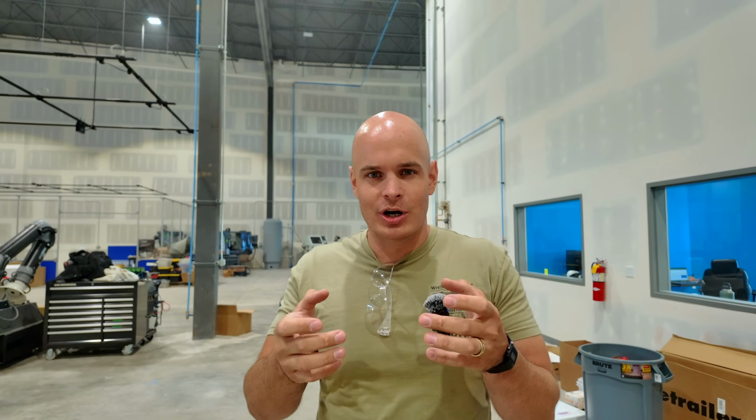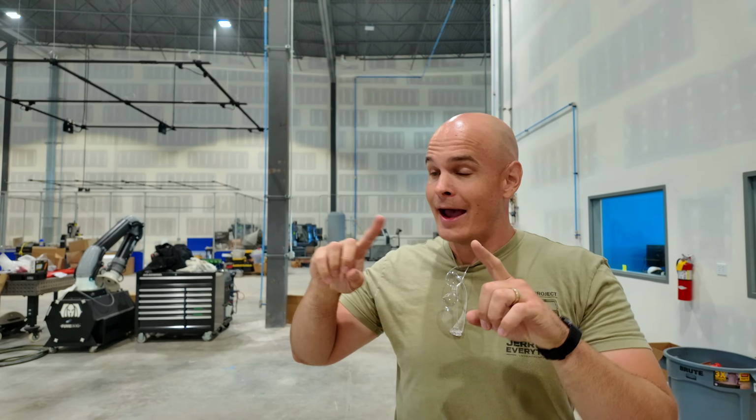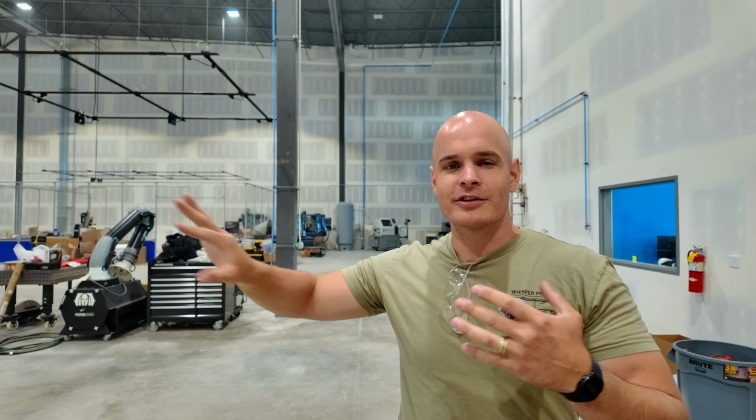It is an active work zone, so we're going to do our best to get all the audio in here. Zach, tell us what's going on in here. It's definitely loud. There are multiple kinds of wheelchairs. There's the kind you see at hospitals, where someone's behind you pushing, and those cost anywhere from $100 to $200. Then there's a rigid manual wheelchair, which someone who's permanently in a chair pushes around, and that can cost anywhere from $4,000 to $10,000. That is the kind we're building here, and we're building it for 80% cheaper than anyone else. I'll show you the exact machines we use. There are also powered wheelchairs, but those are way more complex, and we'll tackle those at a later date.